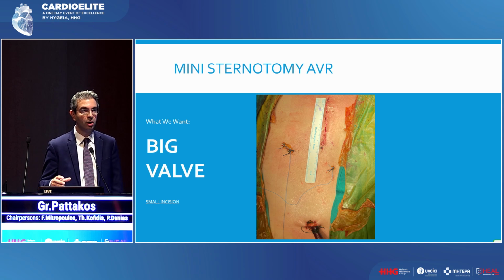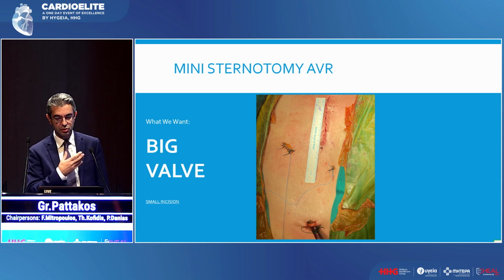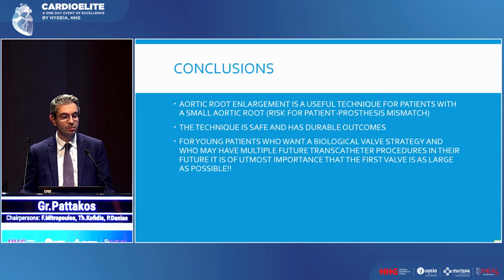Our patients really want minimal surgical trauma. This is our mini sternotomy AVR. And they want the biggest valve possible through the smallest incision possible. It sounds hard, but it's not as hard as it sounds to do. We've seen a number of surgeons here at the Pantheon today of minimally invasive surgery. And I thank you. I did my best to be quick.